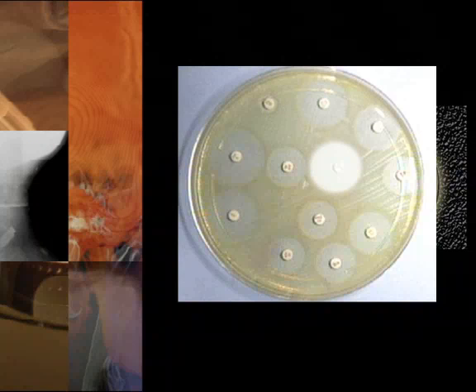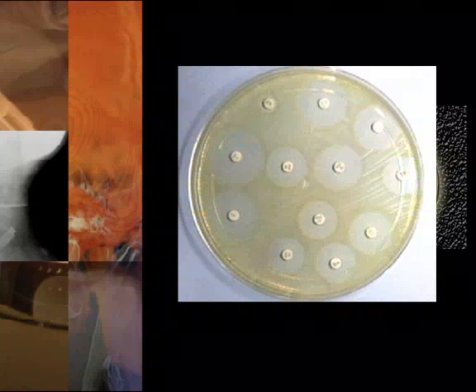These clear circles around the disc show that the bacteria isn't able to grow in the presence of that antibiotic. And so that tells us that if you see a clear circle, that antibiotic will work. And a person that can help us determine the results of these antibiotic susceptibility tests, as we call them, can be a clinical microbiologist. Sometimes they can do additional tests that will help them tell whether or not bacteria have developed the capability to resist an antibiotic.